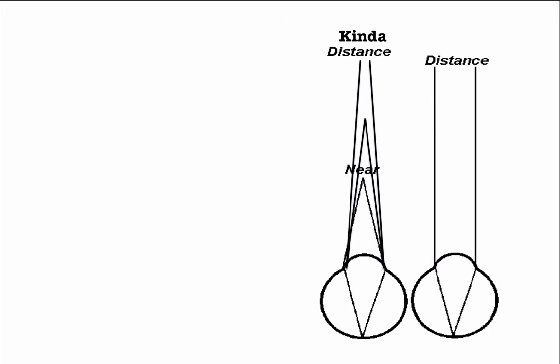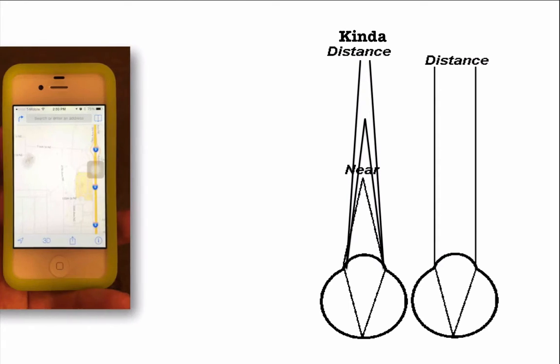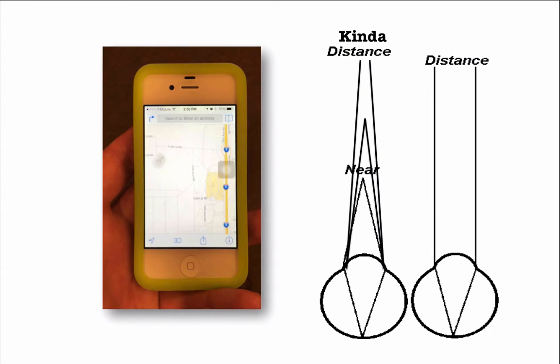In doing so, we don't recommend showing them the distance chart, but rather their cell phone at first, because their near vision is what they're complaining of the most, and if we can share with them how it's better at that distance, then we can allow them to adapt and experience a modified distance vision.